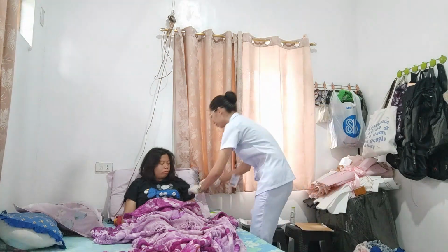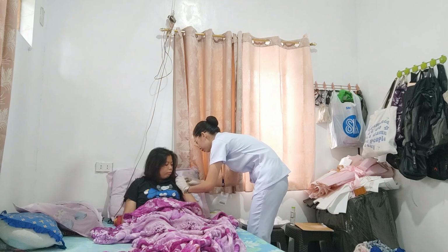Okay. Then we're going to examine the integrity and amount of the patient's muscle mass and palpate the muscle area. Inspect the area for bruising, inflammation, or even edema. If the skin shows bruises or inflammation and tenderness, then this site might not be suitable to be an injection site. Okay, ma'am, I'm going to roll your sleeves.